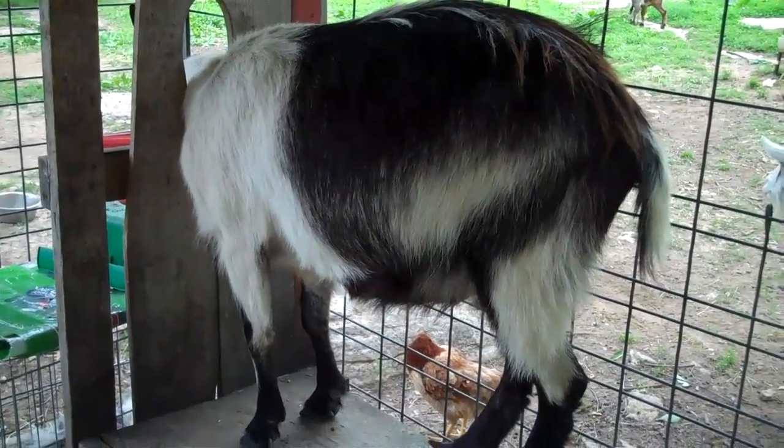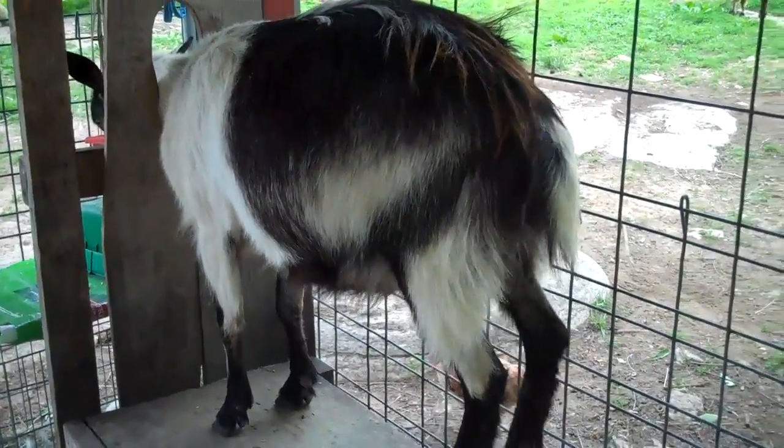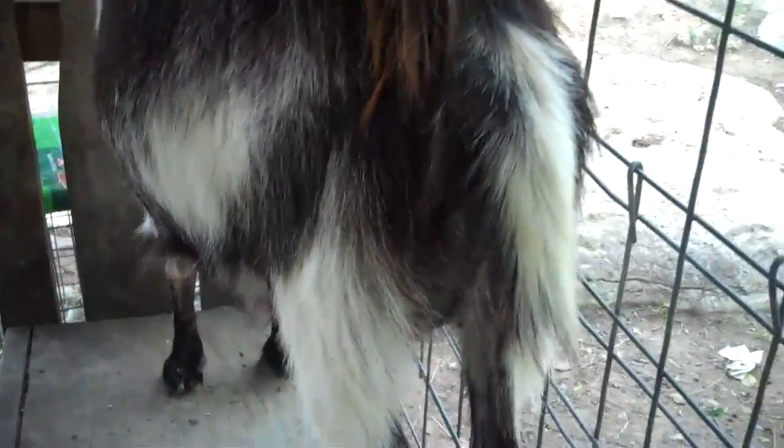This is Ms. Beryl, and she has made an udder, so I know she's pregnant already, and due probably within the next 30 days. We're going to try her anyway. Let's see if we can see her udder — she's making a little udder. Okay girl, you are pregnant. Let's get you out of here.